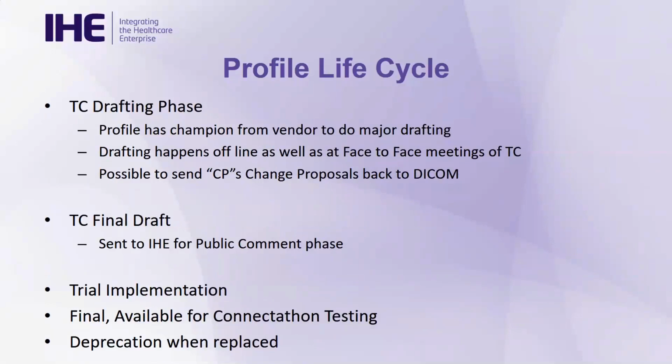A lot of the people who are involved in IHE-RO are also on the DICOM committee or have been, Working Group 7, which is radiotherapy. So there's a good relationship between the two and a good degree of coordination. Final draft will be sent out for public comment. Then there's a trial implementation, final, and then it's available for connectathon testing.